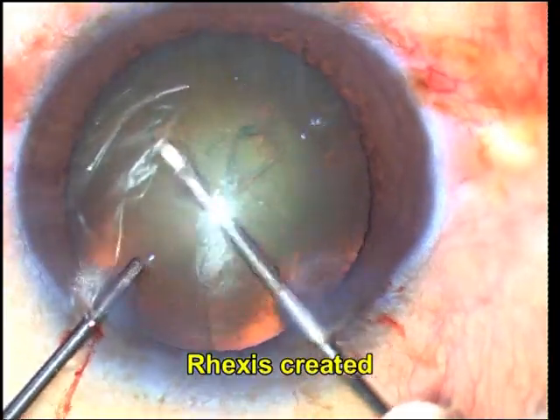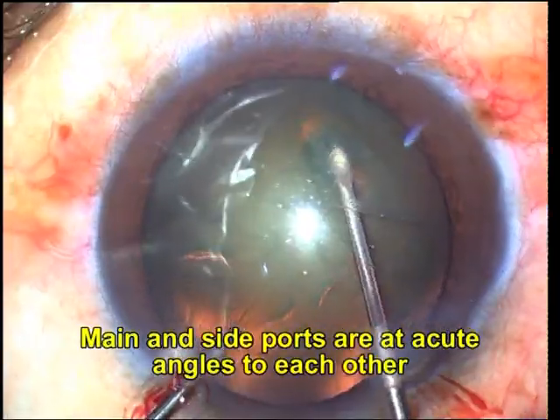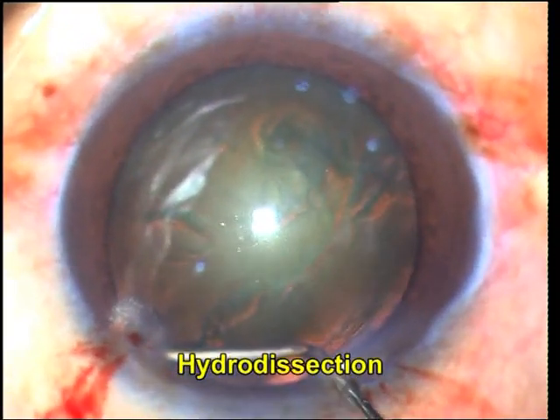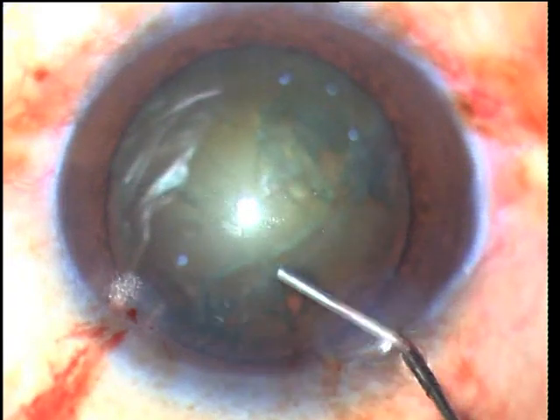A well-centered rhexis of about 5.5 mm size should be aimed for. An inferiorly decentered rhexis can make superior sculpting difficult. Similarly, a too large rhexis can cause excessive movements of the nucleus within the bag and can cause the nucleus to repeatedly prolapse out of the bag while sculpting.